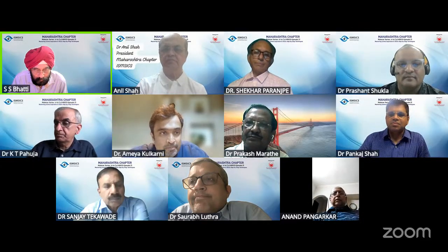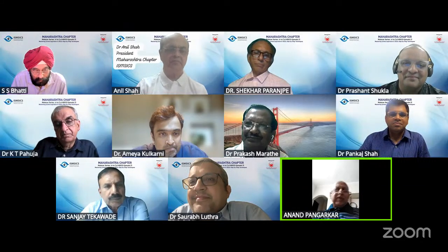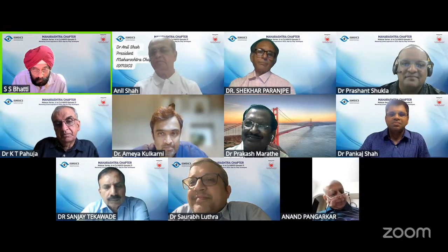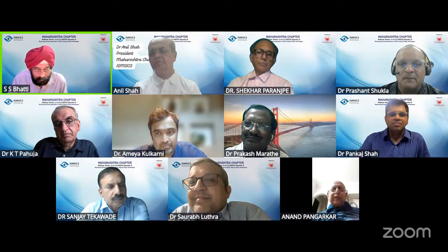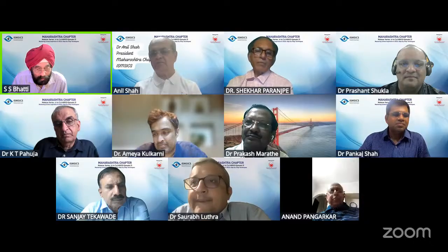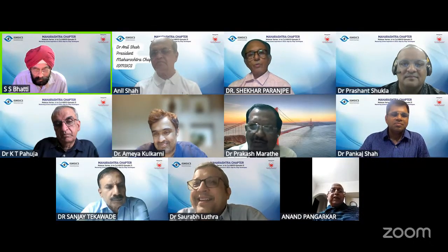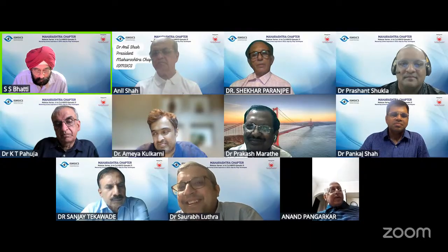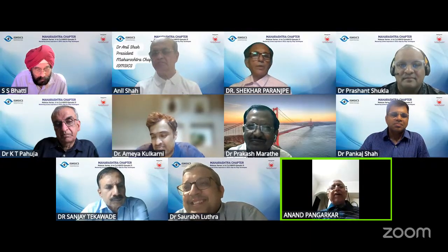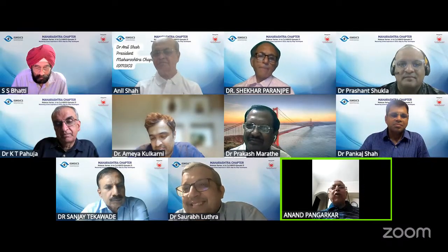This is not to say that we must go back to those days, but it is to say that if you do not get a CCC sometimes, it's not the end of the world. The eye will do pretty well. Yeah, okay. It is known as romanticizing the past. Not really. You have to appreciate the good things about the older. I'm giving a compliment that there were some good things also, not all bad things.